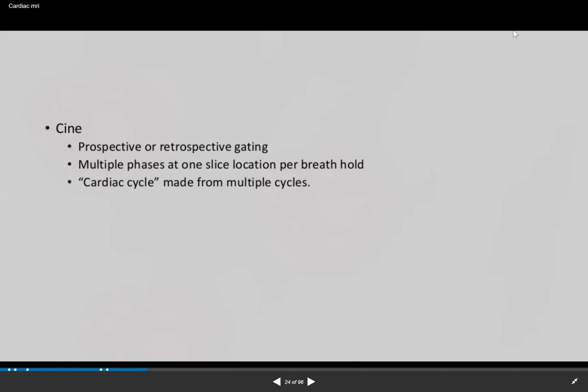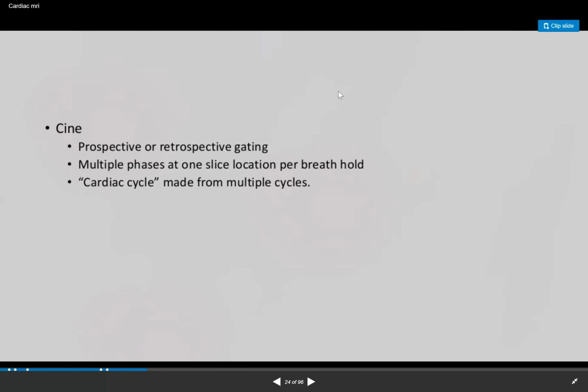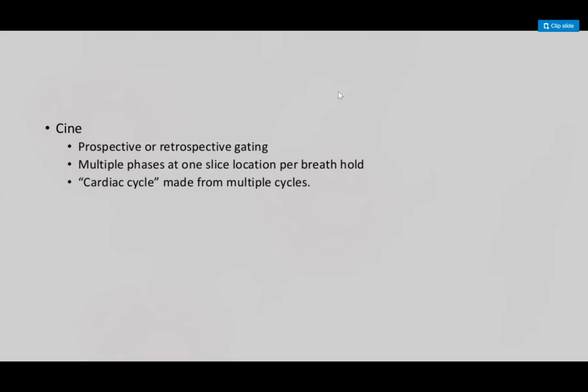Waqas, can I just ask you a quick question on the black blood imaging? Mm-hmm. Will black blood imaging, the spin echo imaging, give you any T2 information? The shortest answer is it doesn't, but you can change the sequence in a way that you can have T2 weighted imaging.